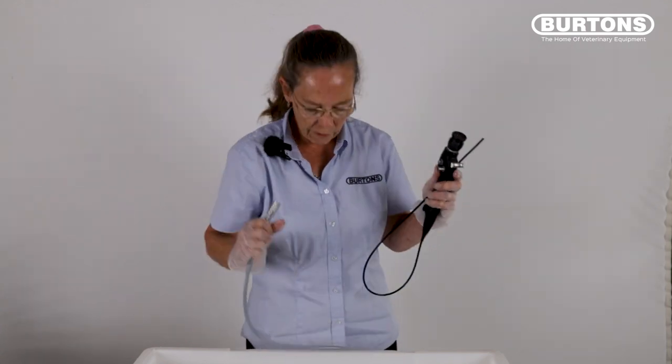Detach the light guide cable from the endoscope. Be careful because the endoscope connected into the light box — this probe can be hot, so let it cool down before you immerse it.